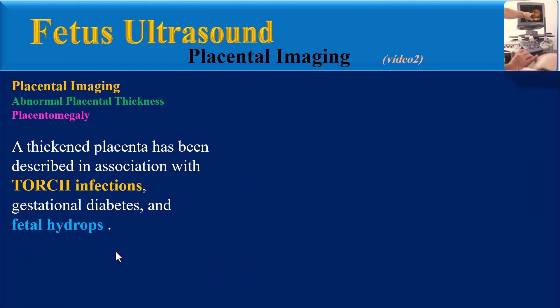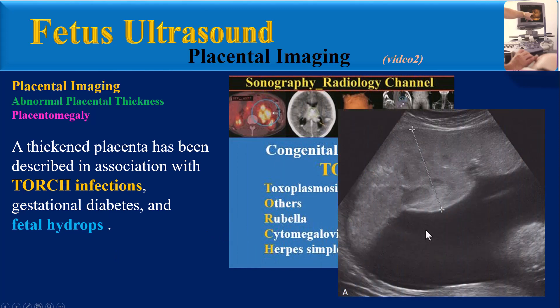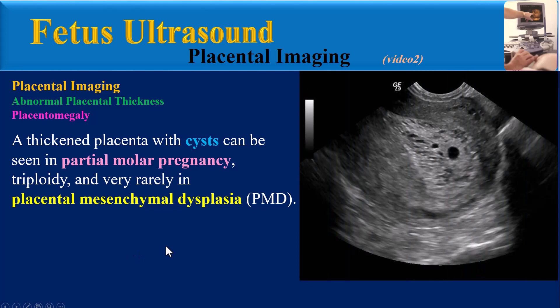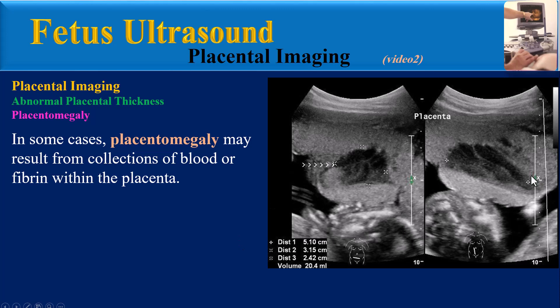A thickened placenta has been described in association with TORCH infections, gestational diabetes, and fetal hydrops. This anterior placenta measured about 7 cm at 28 weeks gestation; the fetus was hydropic in the setting of trisomy 21. A thickened placenta with cysts can be seen in partial molar pregnancy, triploidy, and placental mesenchymal dysplasia. In some cases, placentomegaly may result from a collection of blood or fibrin within the placenta.